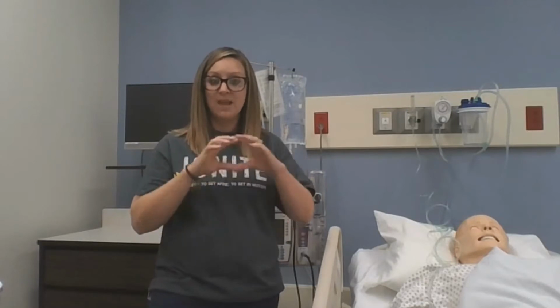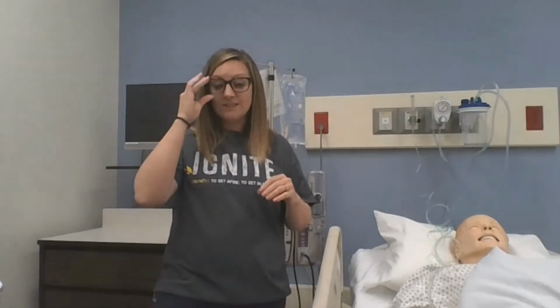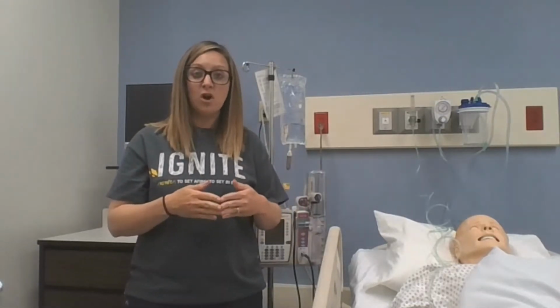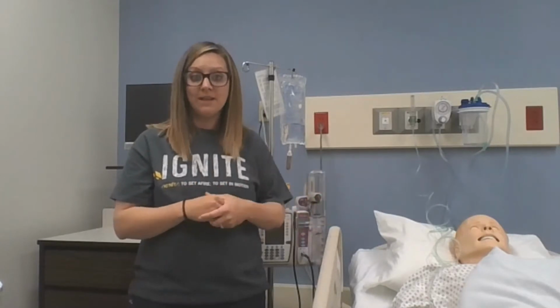But those Phenergans and the Benadryls and those types, the nurses have to really watch for and make sure that we don't also have those ordered for the patients, because you have an order in the nursing text and the communication orders that says that they can't be getting that. And again, that doesn't flow through for pharmacies, so they might have those medications verified, but it's the nurse's responsibility to make sure that they are not administering those sedatives on top of the PCA.